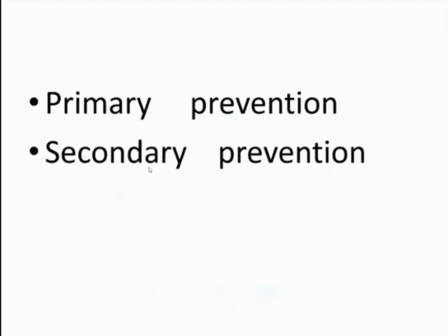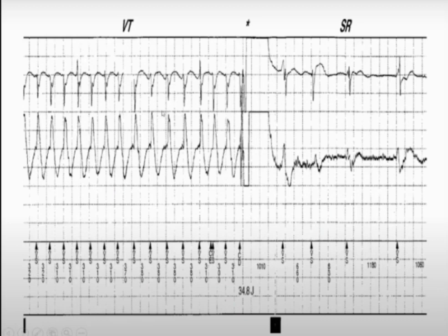هذا هو الICD، يشوفون إنه شلون report ماته، يشوف شلون very rapid arrhythmias here, okay, and there's a shock here, returning back the sinus rhythm here, okay. So this is a VT and this is sinus rhythm after shock طبعا of the instrument.